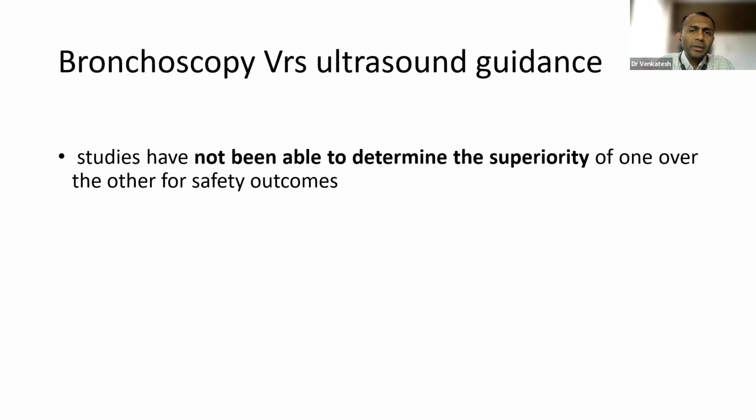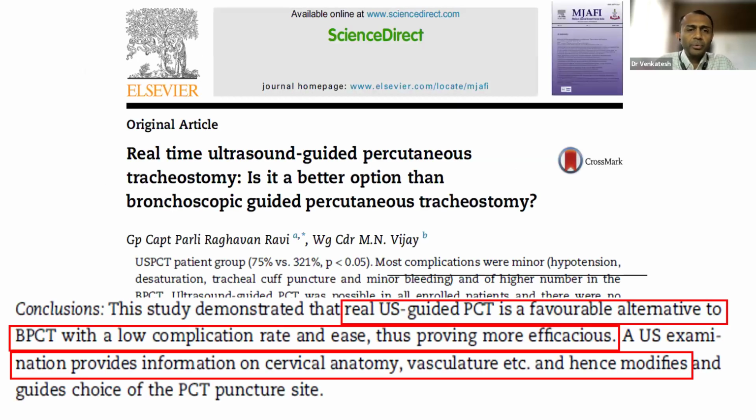So far, there is no study which has determined the superiority of one over the other. It again depends on the unit and your expertise. There are a few studies which have compared bronchoscopy guided versus ultrasound guidance. This is one such study: real-time ultrasound guided percutaneous tracheostomy. Is it a better option than the bronchoscopic guided procedure?